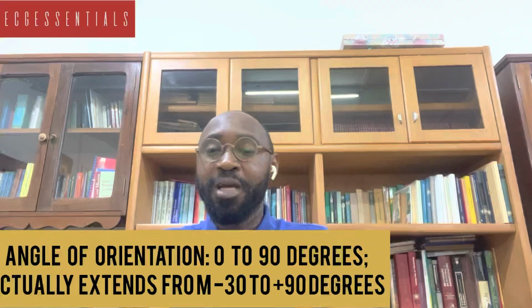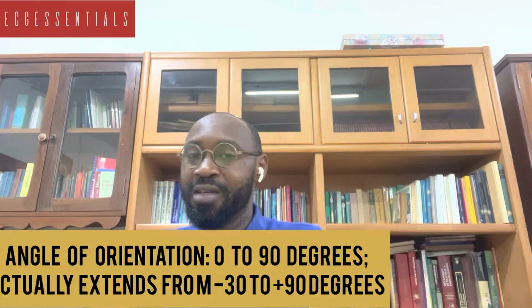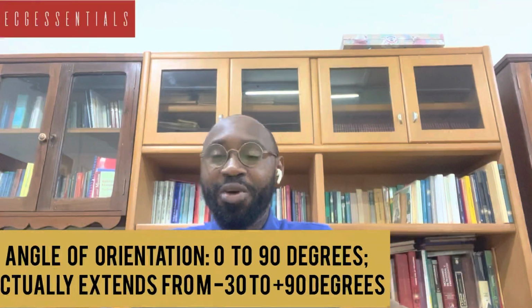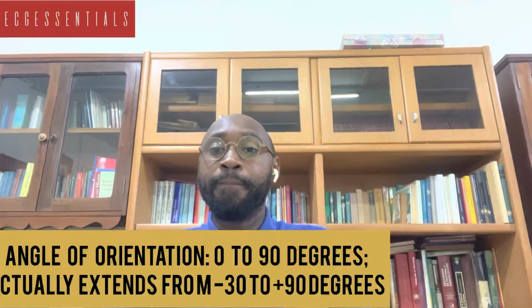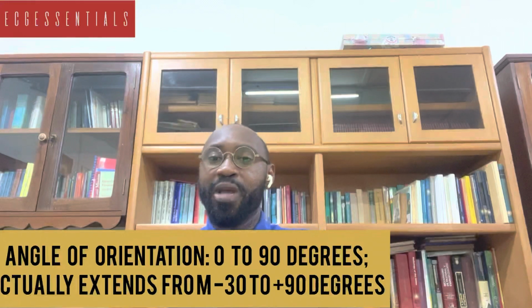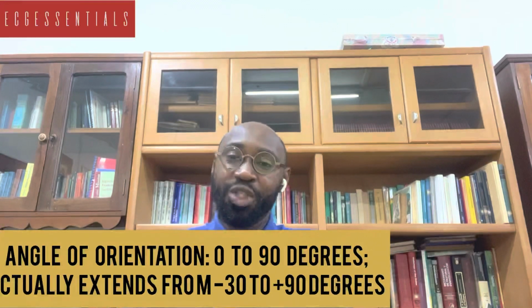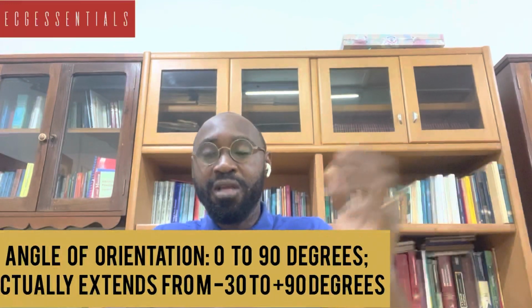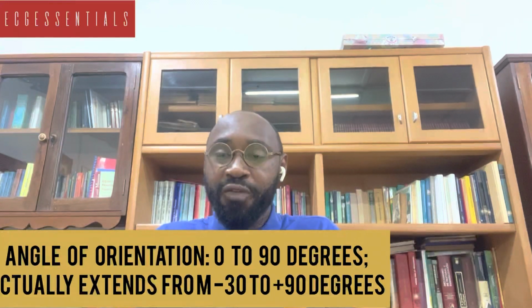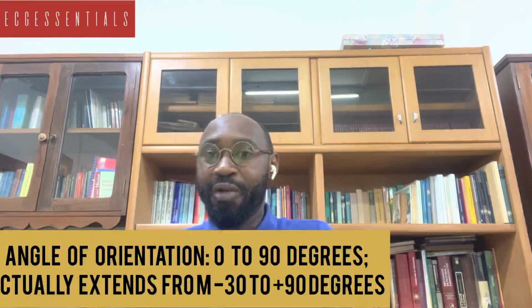Remember, we said that the P wave is directed between the angles 0 and 70. So if the R wave is usually between 0 and 90, then we expect that every lead whose angle of orientation is close to this range will also record positive deflections, and leads that are positioned far away from between 0 and 90 will record negative QRS deflections.